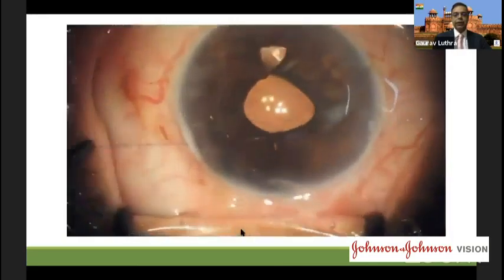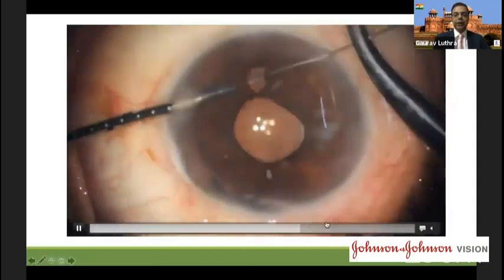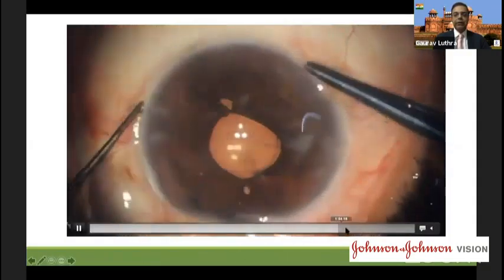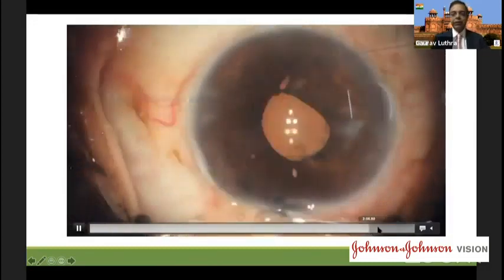So we have a perfect knot here, but I'm not too happy about this open thing here. So this thing requires another one. So let me take you, the technique remains the same. We've managed it and we've now managed to close it. We have a fairly good looking eye over here and this does it.